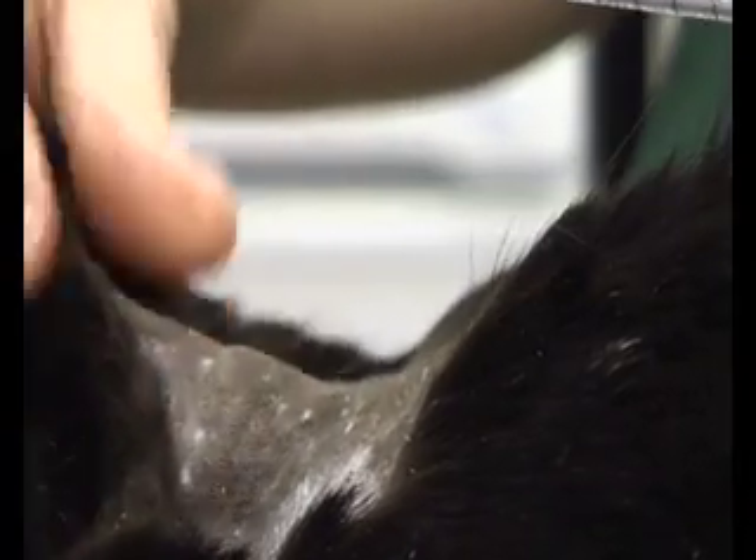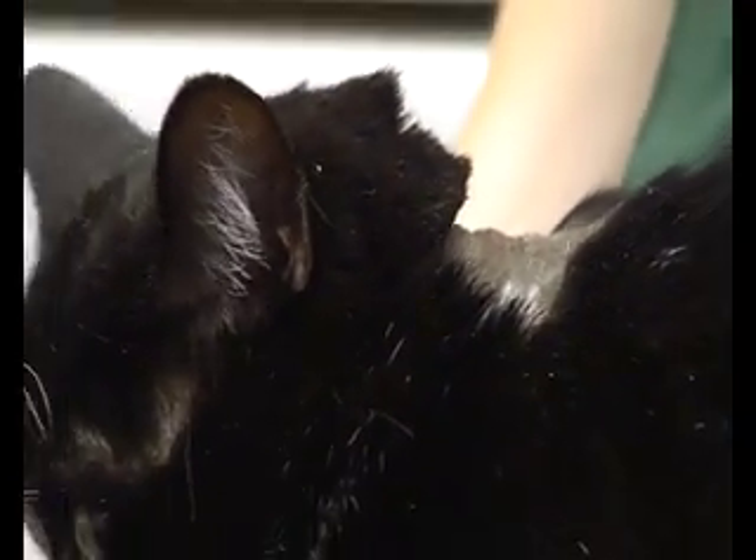Then gently remove the needle, relax the skin, and give a little rub. There you are — it's that easy.